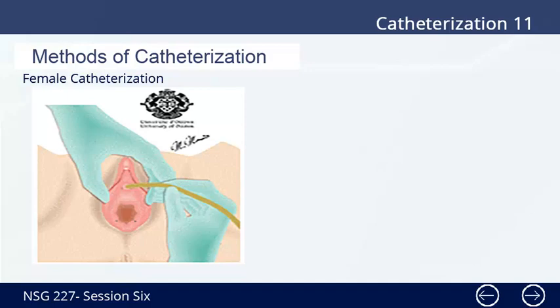5. Wash hands thoroughly. 6. Position the client with knees flexed and legs laterally rotated, or in the Sims position. This places the client in the optimal position for exposing the perineum. 7. Drape the client with a bed blanket or sheet. It minimizes exposure of the body and provides warmth. Enables visualization of the urinary meatus.